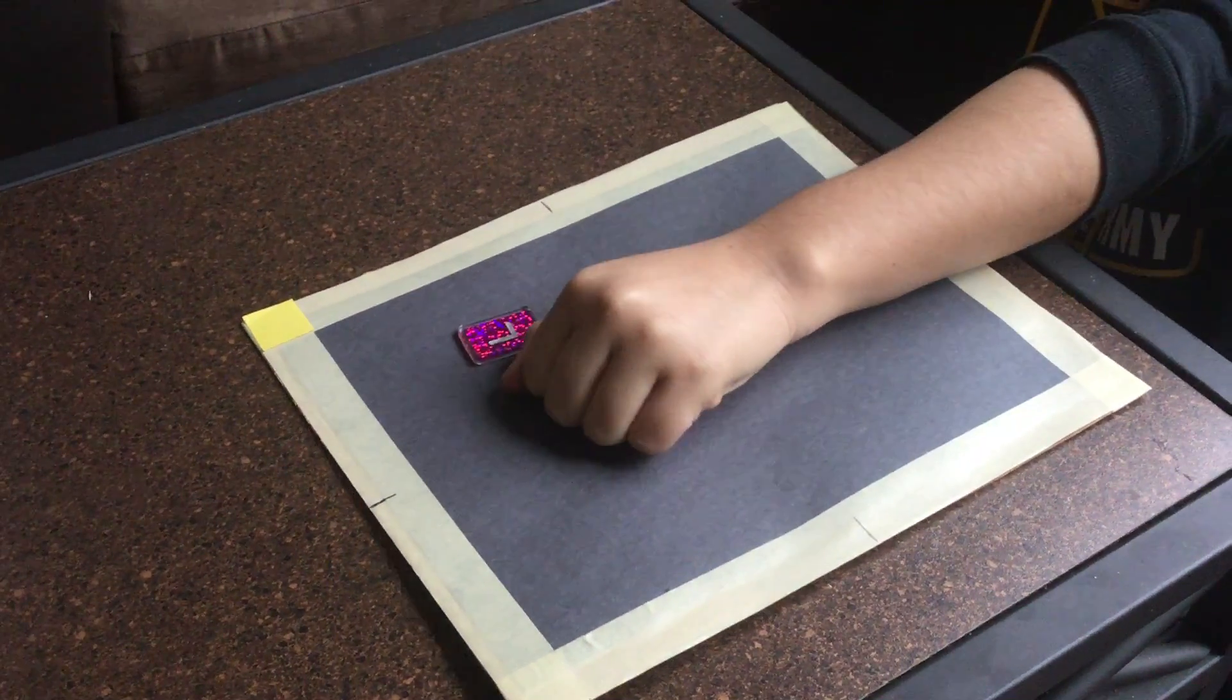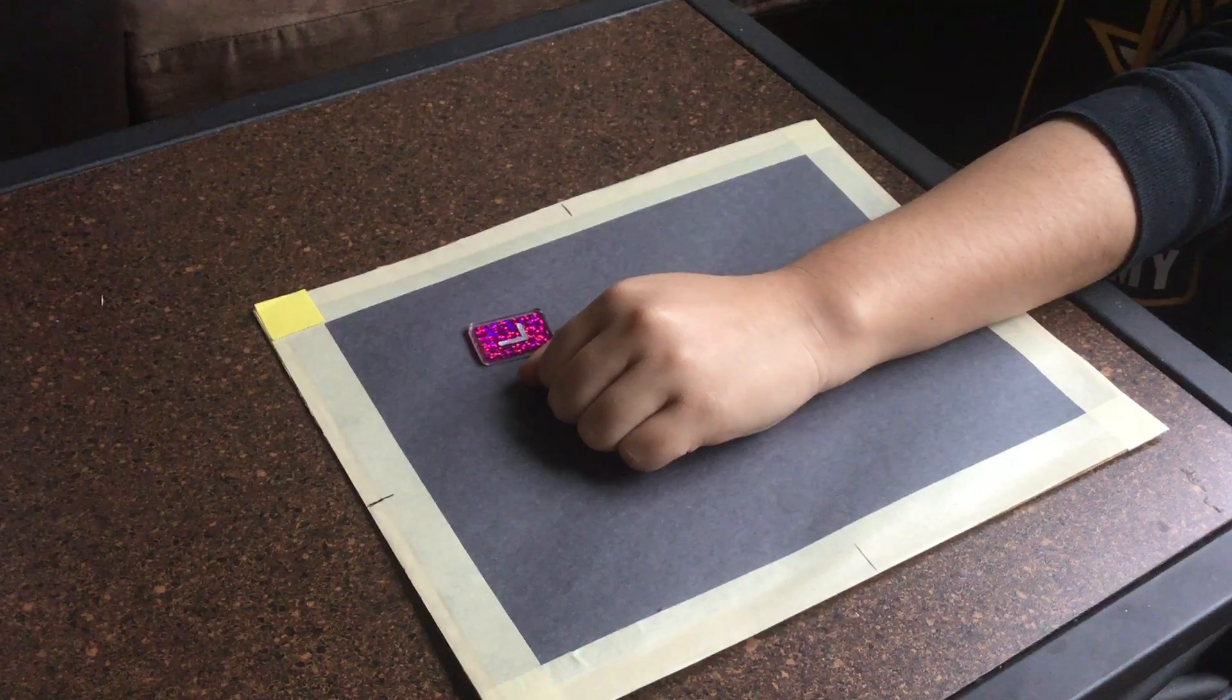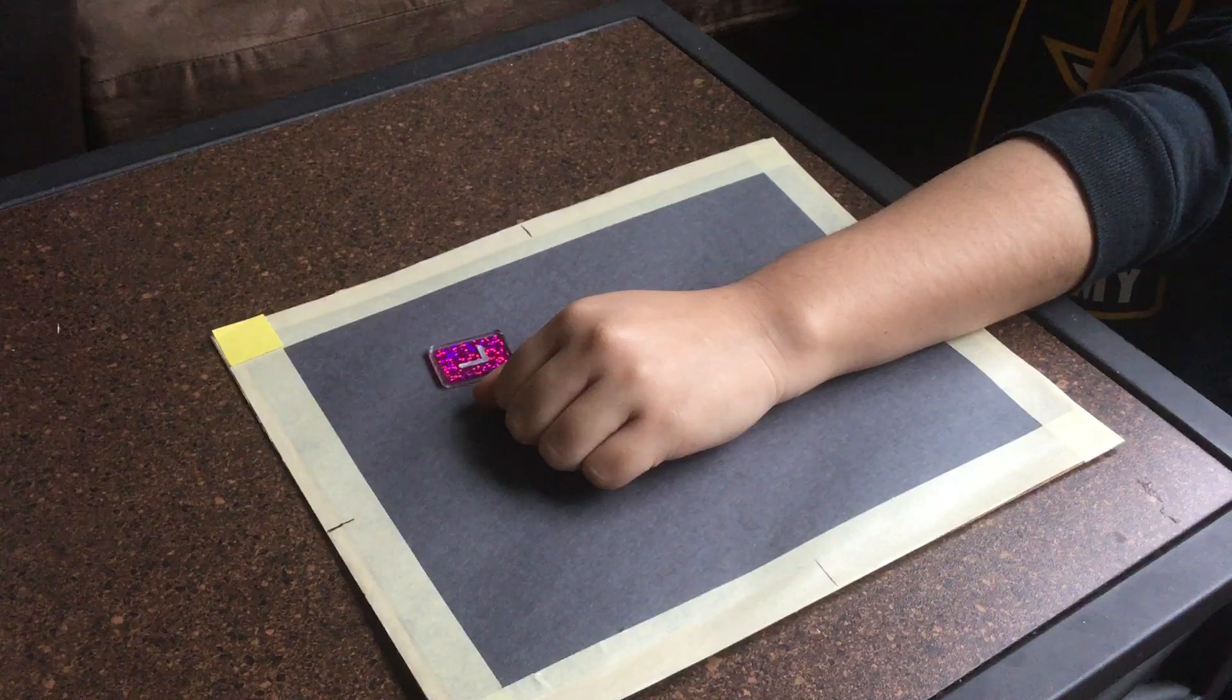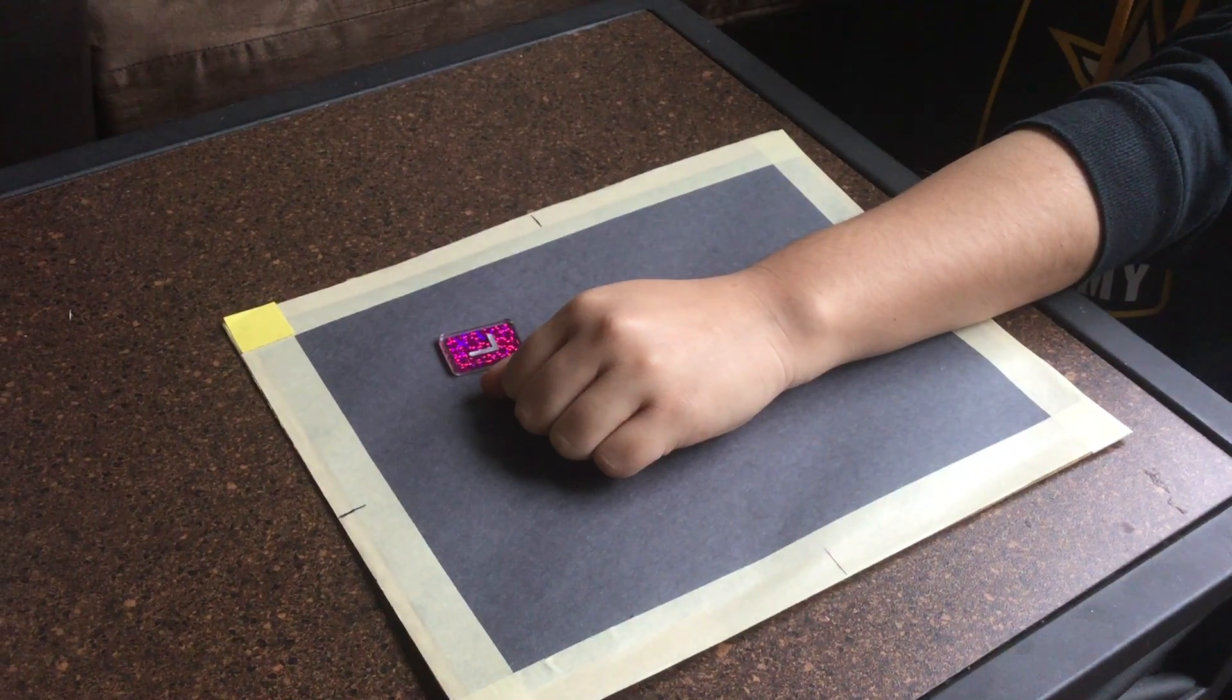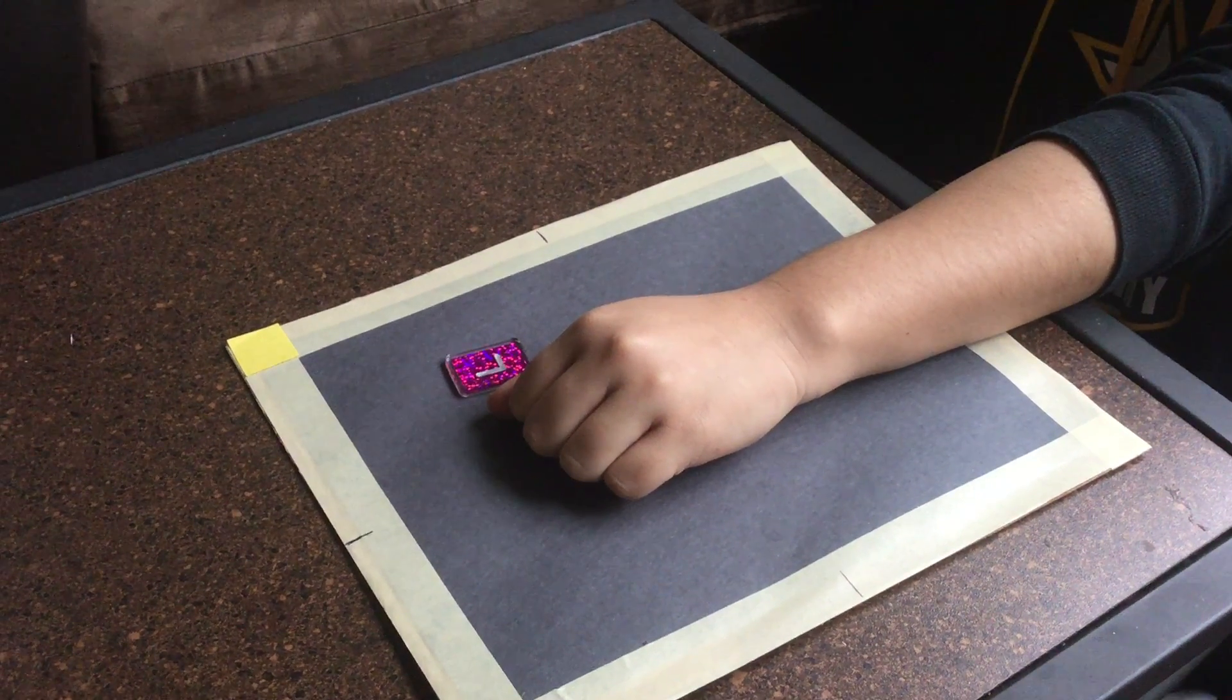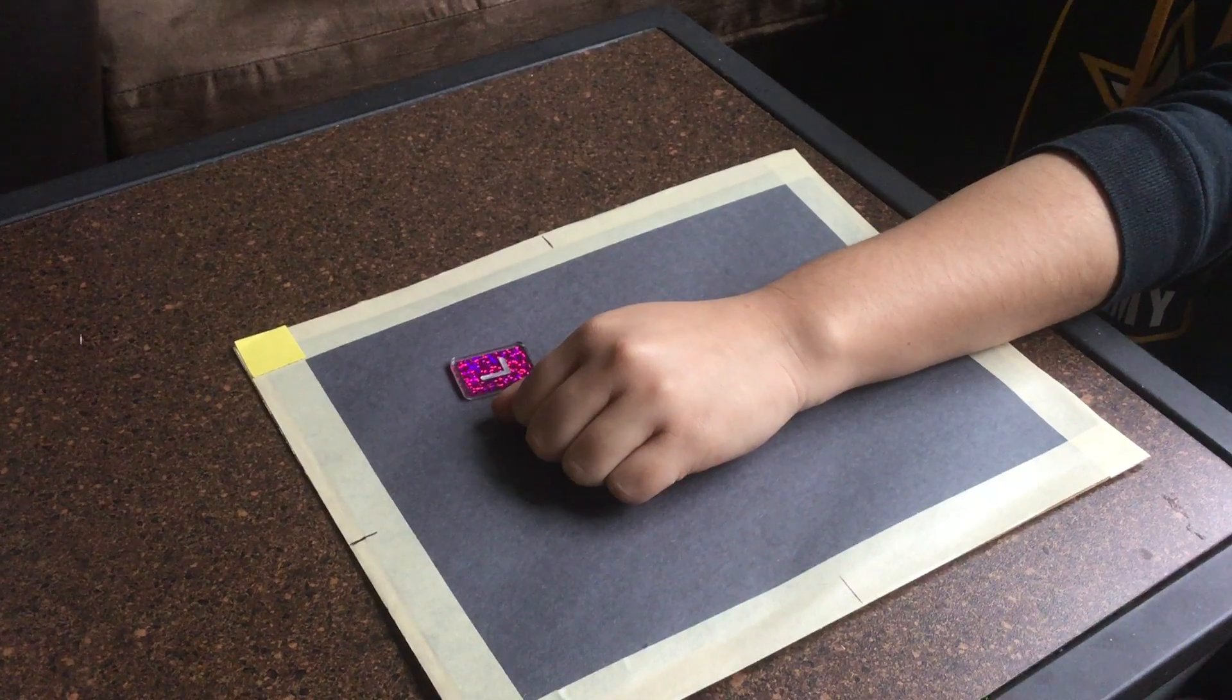So we will place our hand like this, PA wrist, and we see that the central ray is going to go through the mid-carpal area and the collimation is going to include the carpals and the proximal metacarpals and the distal ulna and radius.